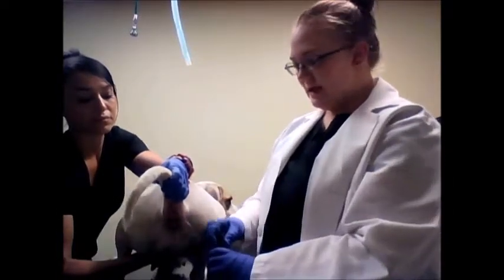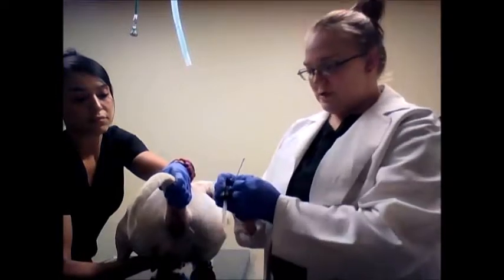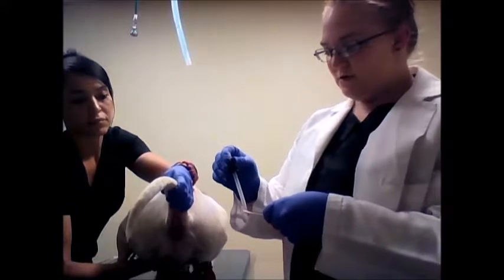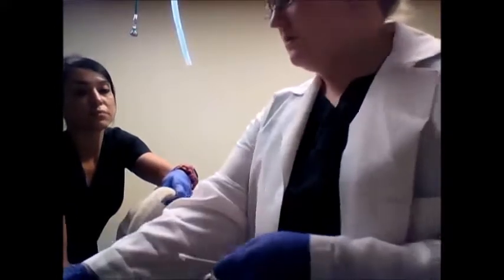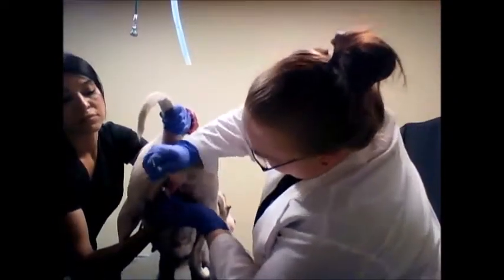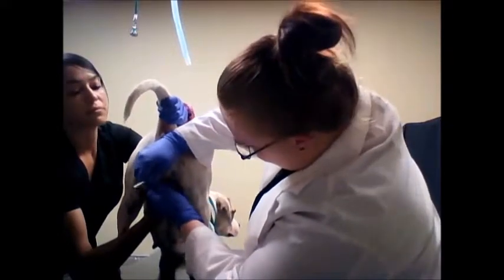Wendy is one of our strays. She is not yet spayed, so your guess is as good as mine as to what we're going to see on the slide here, but I'm going to pre-moisten our swab with saline first. I'm going to go ahead and pull down and insert the swab into her vaginal canal.